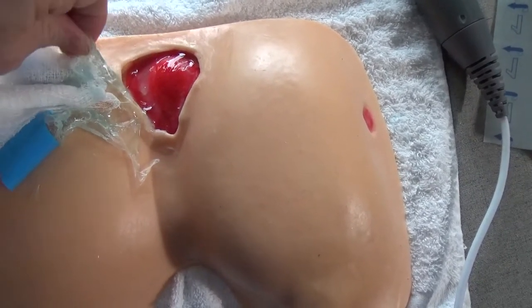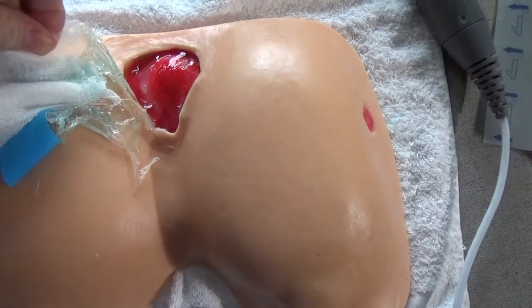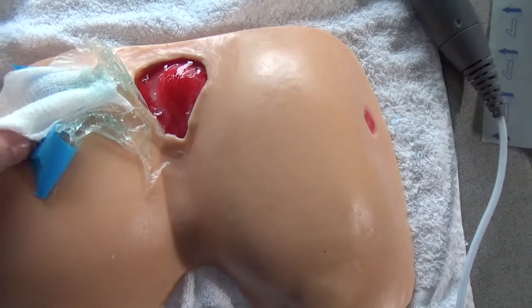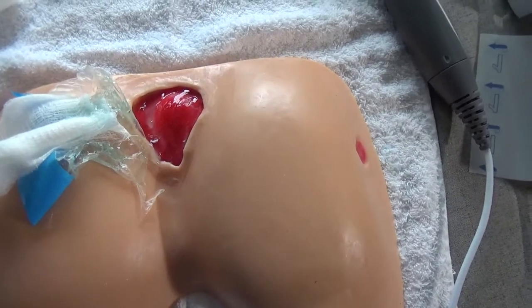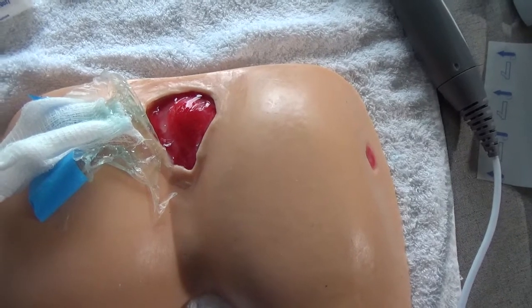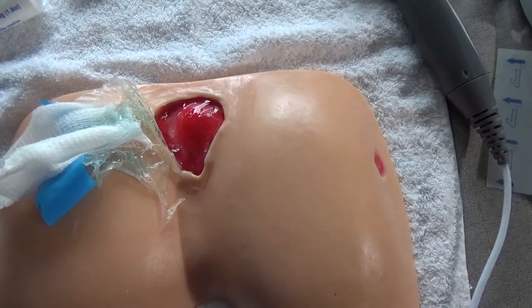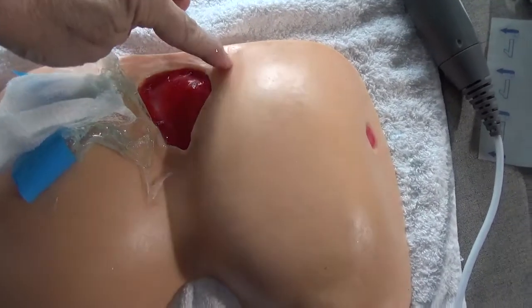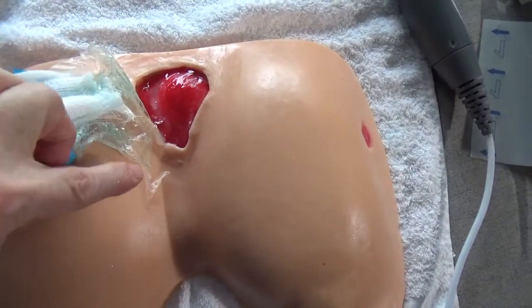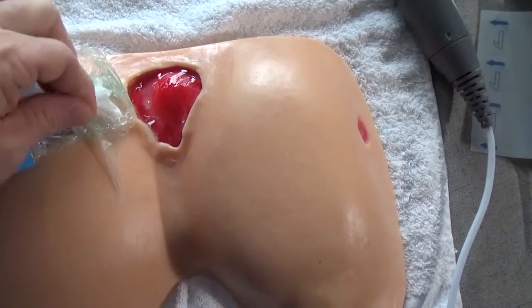This treatment is performed once daily. Typically, it depends on the size of the wound, for 5 to 7, maybe 10 minutes for larger wounds. And then you can document before and after the wound, to make sure that you look at the wound periphery and how that goes and how well the patient tolerated it.